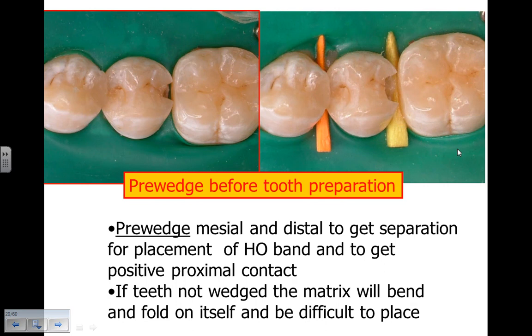Remember, placement of composite doesn't allow me to make a denser composite. It's a very viscous liquid. And it's similar to when you sit into a bathtub of water. When you sit in the bathtub of water, the water rises, Archimedes' principle. The same thing when you place an instrument in composite, the composite will rise up on the sides.